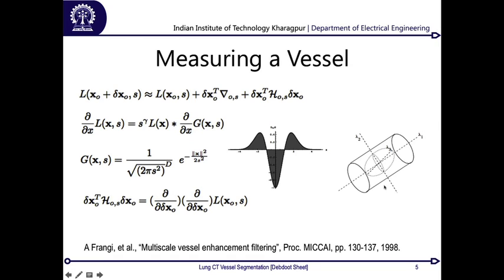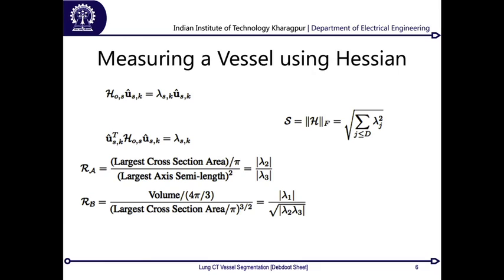So you would have one over here, another over here, and another somewhere in between. This is for a perfect cylinder, but if you have a curved cylinder, then these axes would no longer be aligned along the x, y or z axis, but they will be aligned along the length, and as your cylinder changes along the length, these unit vectors will also be changing. But what we are more interested in is the magnitude of this eigenvector, which is my lambda factor.